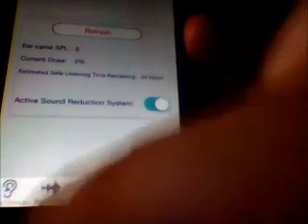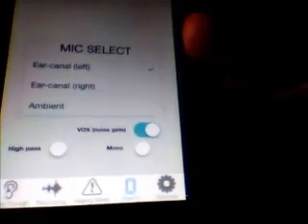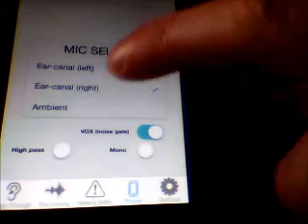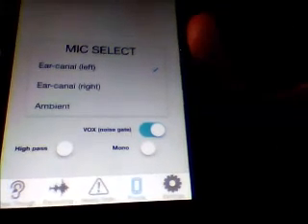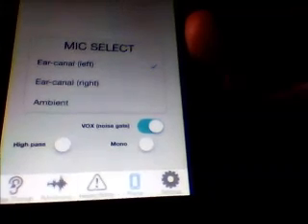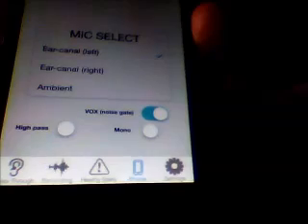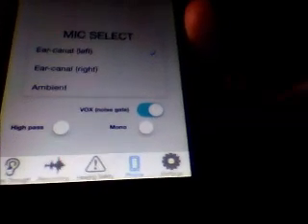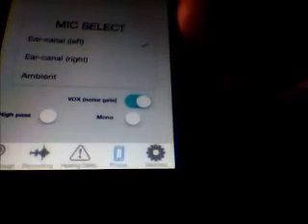So now onto the phone settings screen. This mic select menu sends a BTLE command to select the microphone pickup used for the outgoing signal in a phone call from the earphone hardware. This Vox switch sends a BTLE command to enable or disable the voice activated switch in the outgoing signal from the earphone during a phone call.